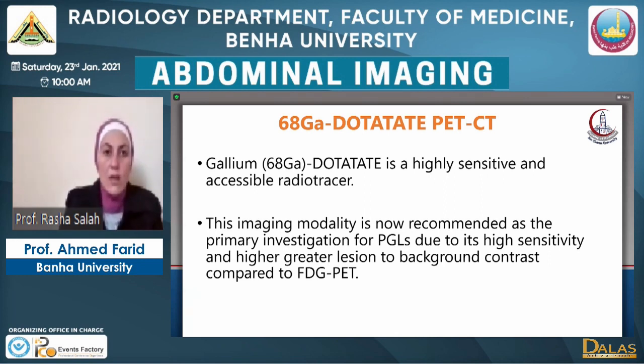It just relies on the presence of the somatostatin receptors on the cells of this tumor. It is very sensitive to assess the pheochromocytomas and paragangliomas, not only the primary tumor, but also its metastasis against the background contrast compared to the FDG PET.